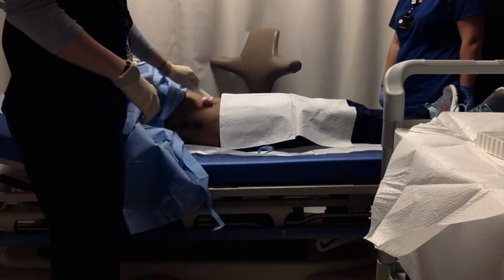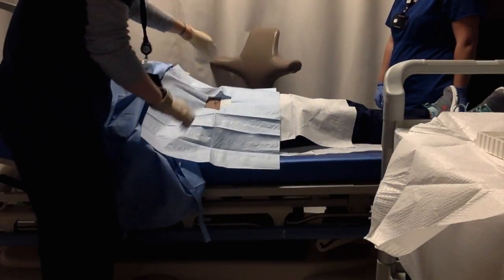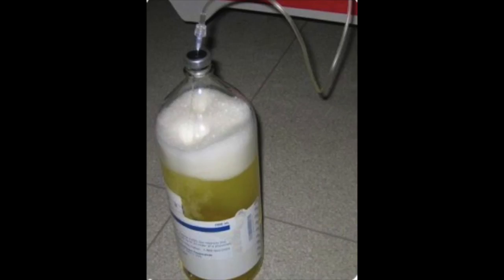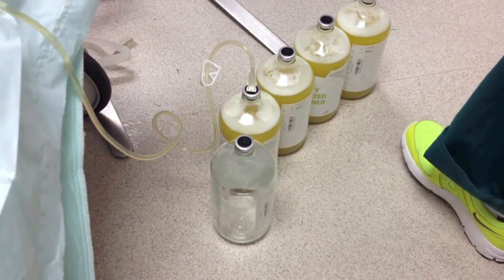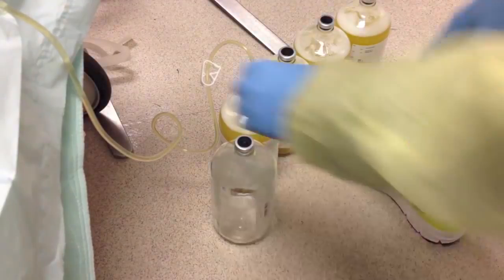Antiseptic should be used to clean the area, and sterile covering should be placed over top of the site. The radiologist will use a needle that is ultimately connected to a tube with a needle on the other end. Once the radiologist inserts the needle, he or she will hand you the other end of the tube so that you can insert it into the glass vacuum bottle. During the procedure, the tube will need to be switched from one vacuum bottle to another once full.